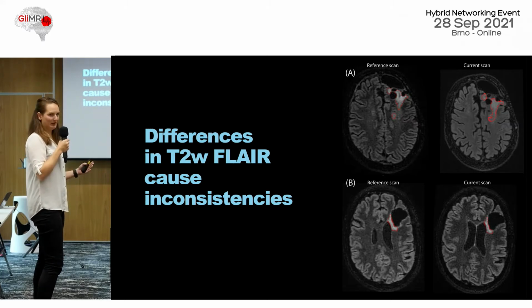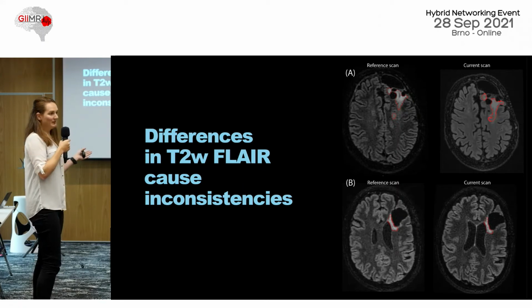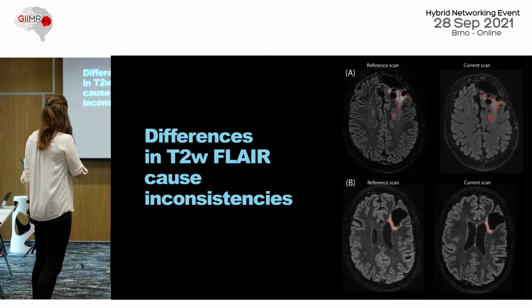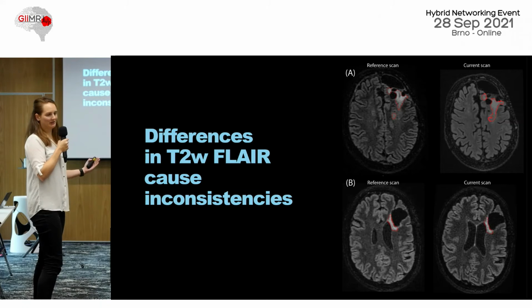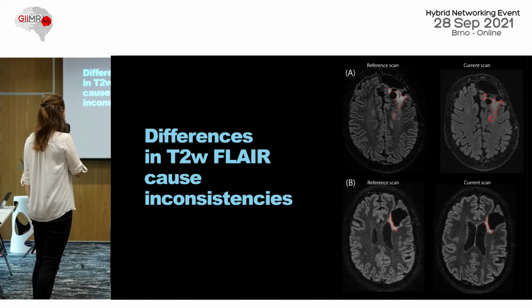But then when you compare them, especially in low-grade glioma, which can be quite small, very often you get a big increase in volume just due to changing the boundary a little bit. So in some cases, this will happen. That's why it's very important that the actual segmentation is stored in the PACS, so the radiologist can always look back and think, okay, I see a volume increase, but actually this is due to the segmentation being a little bit different.